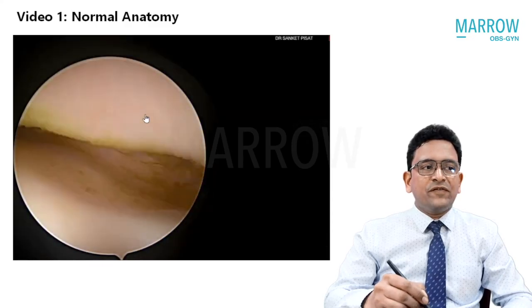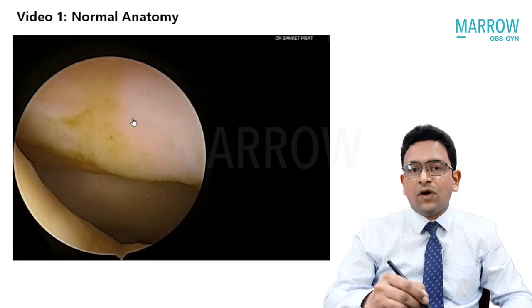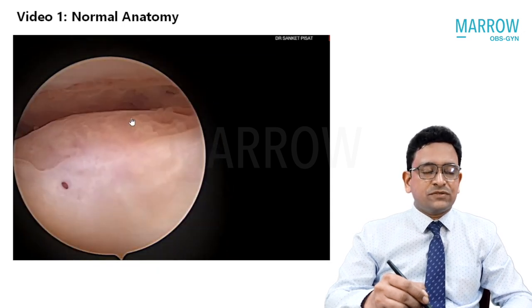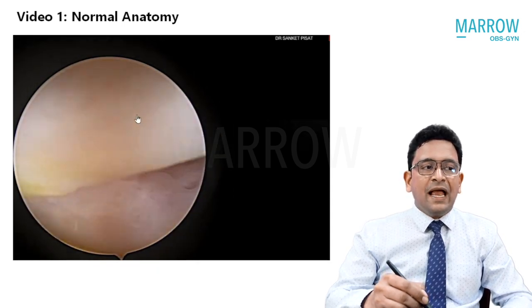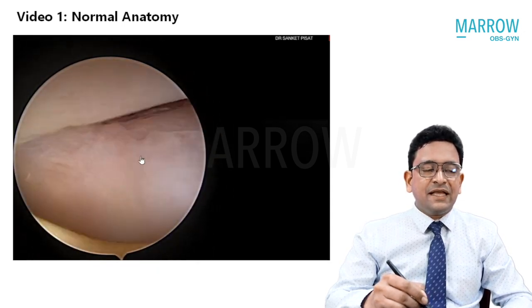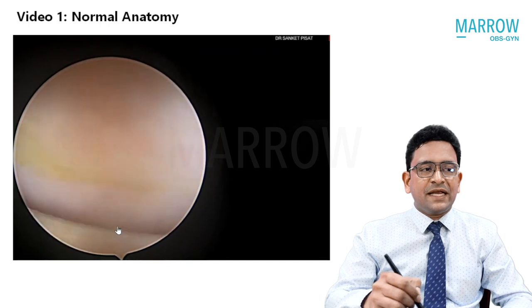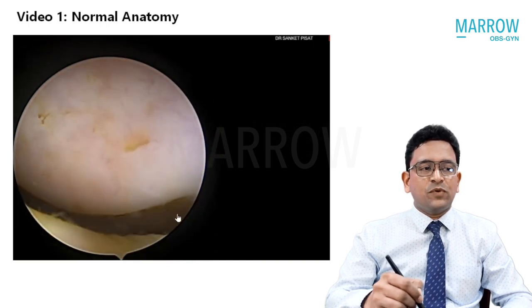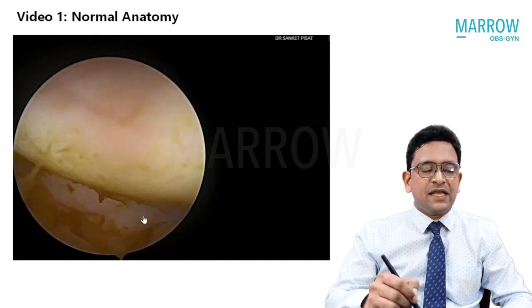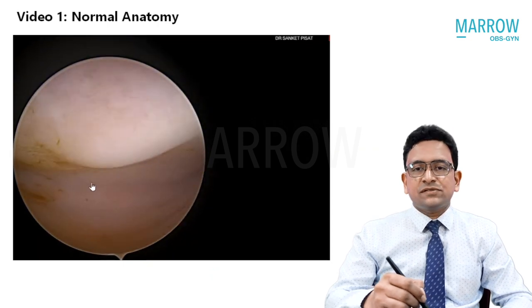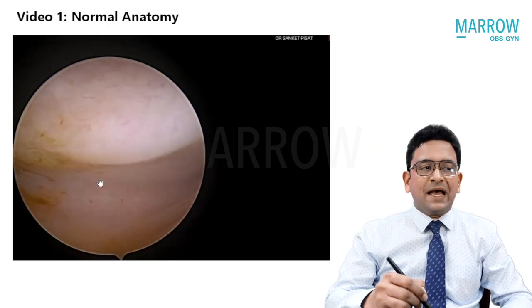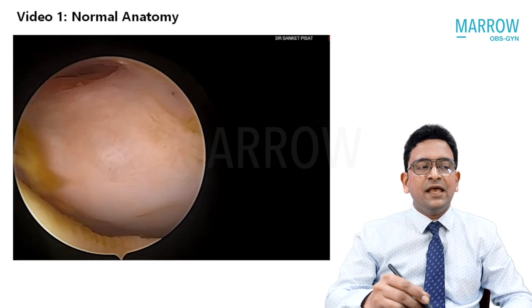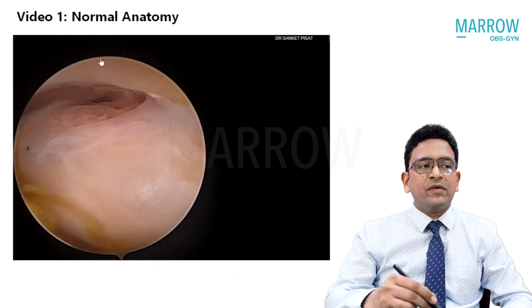Let us take a look at a video of the normal anatomy. This is the hysteroscopy which is being performed. As we go inside, first we are able to delineate the posterior vaginal fornix, and as the hysteroscope moves back and then gradually forward into the uterine cavity, we proceed further.